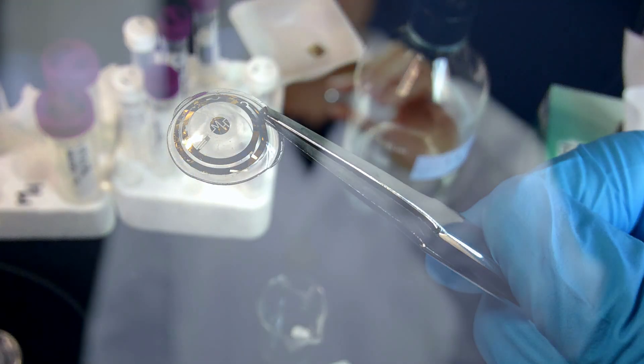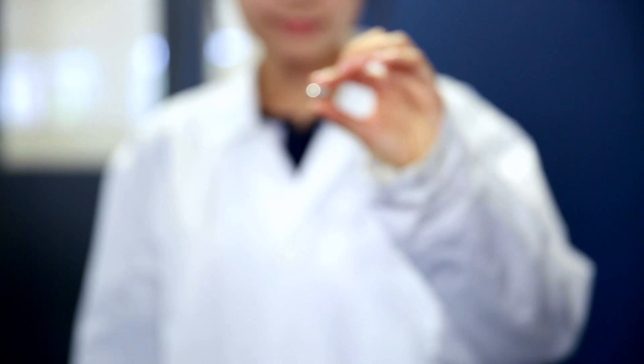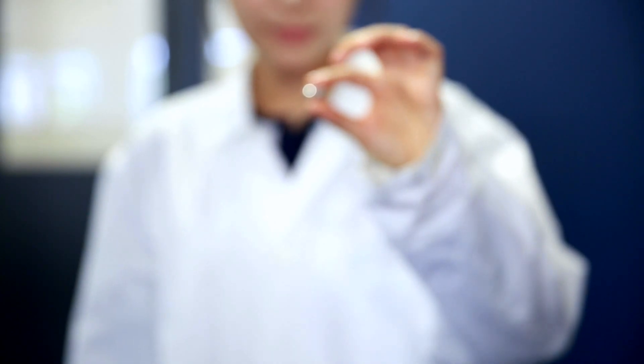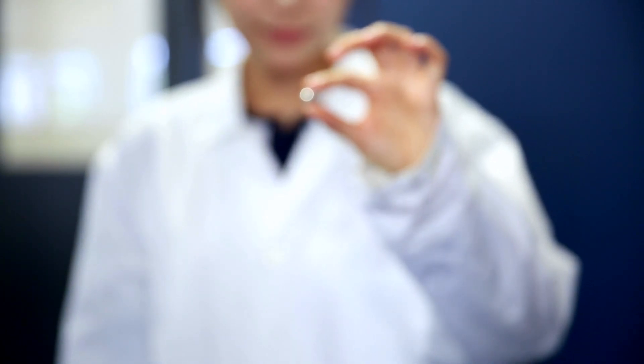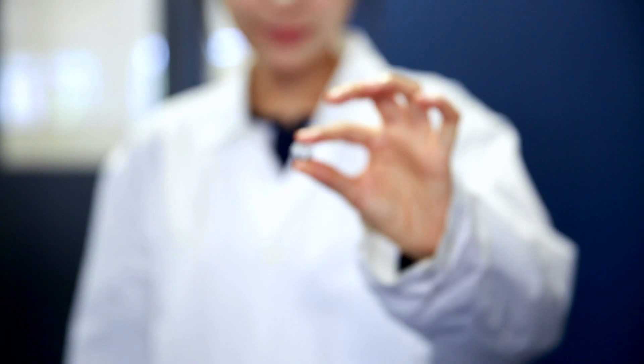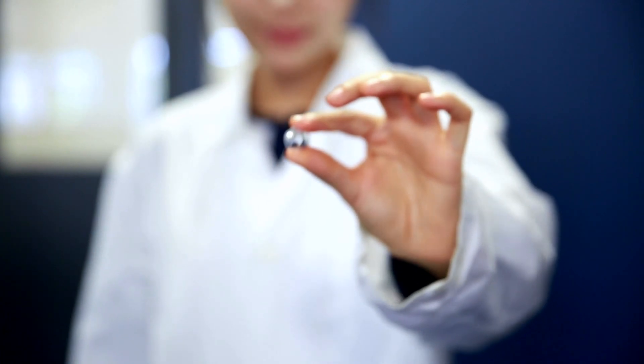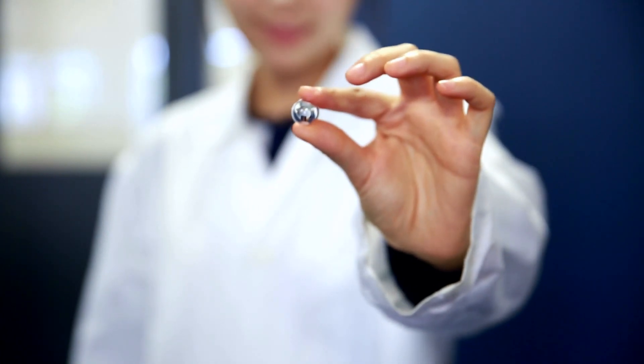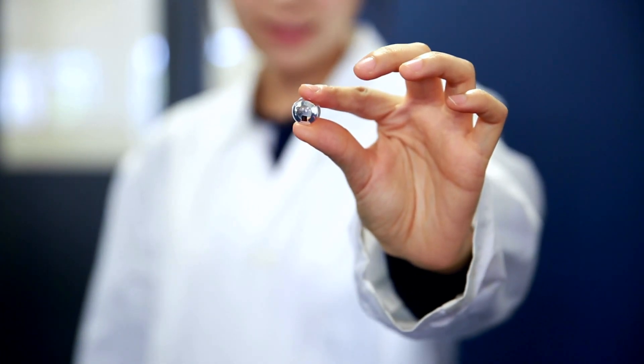The real challenge that lies ahead is to get all of these components to work together, seamlessly, and eventually in a form factor that will fit a contact lens.